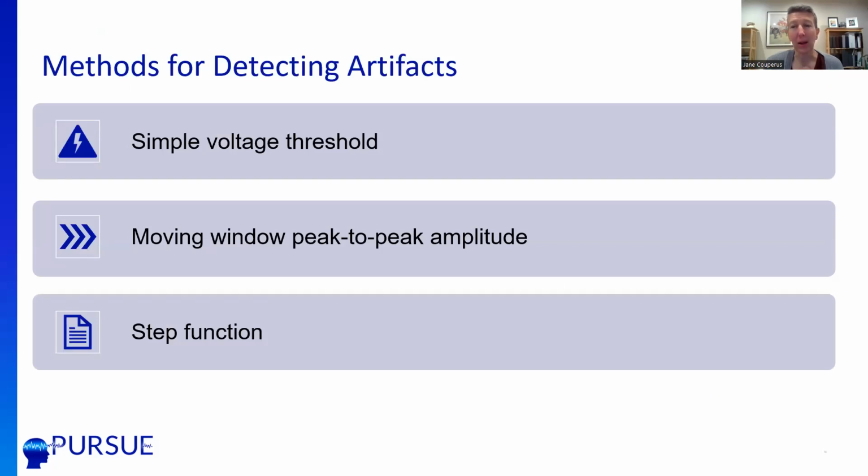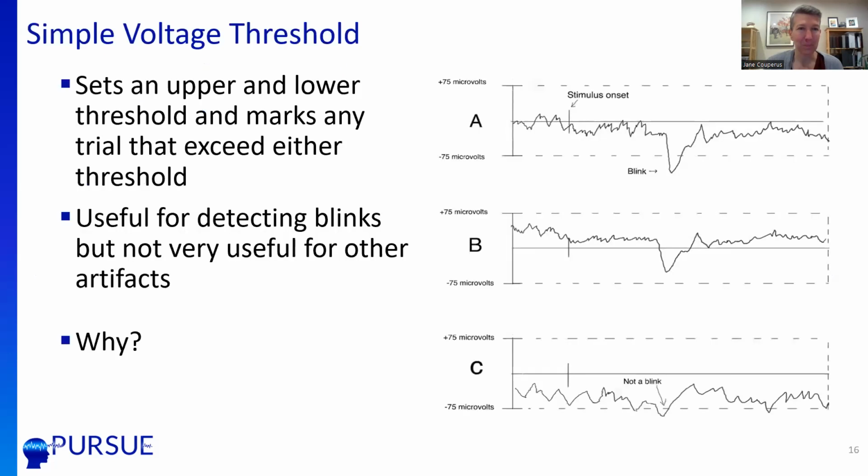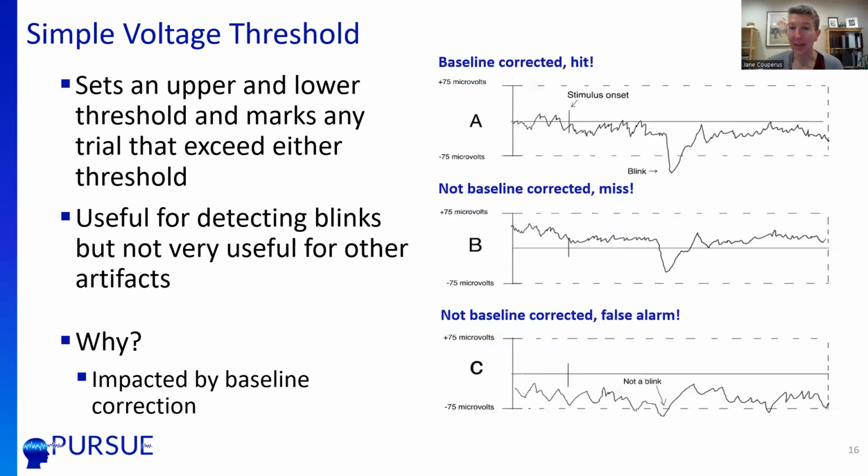There are a number of methods. We're going to be doing the practicalities of the simple and moving window peak to peak, but I'm going to show you what a step function can do for you as well. So first, simple voltage threshold is exactly as it sounds. It sets an upper and lower threshold and marks any trial that exceeds that threshold. It's useful for detecting blinks, but it's not super useful for other artifacts. And part of this is because it's impacted by your baseline correction. And so you want to make sure you're using your baseline correction before you do this, because if you have baseline corrected, you might catch a blink. But if you haven't baseline corrected, the activity might not actually fall in your window of your threshold. So you might miss it, or you might even have a false alarm because the data is too close to your threshold. So you definitely want to make sure you baseline correct if you are using this methodology, but it can be good for picking up those blinks.